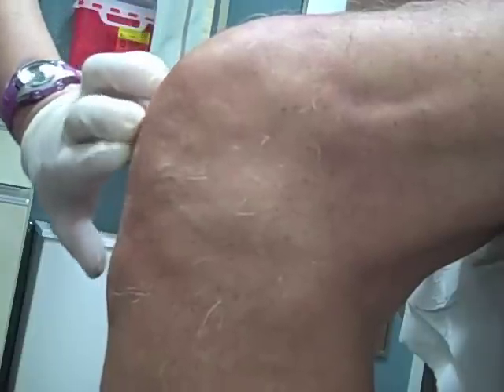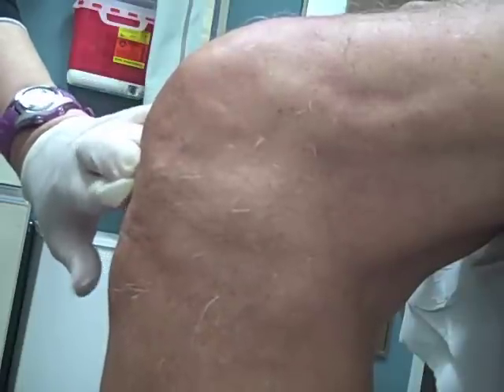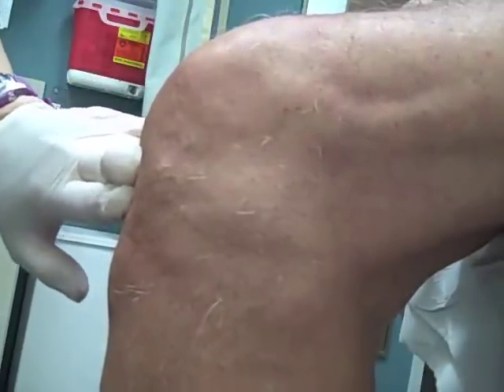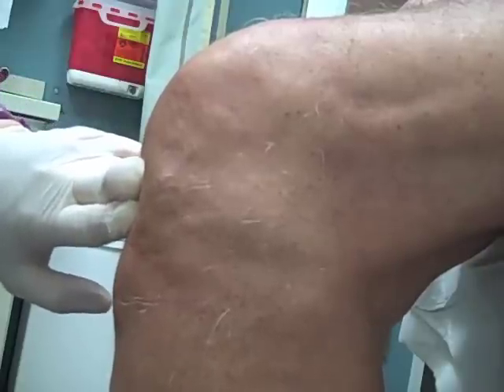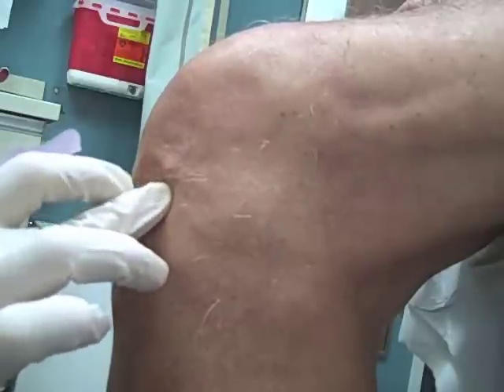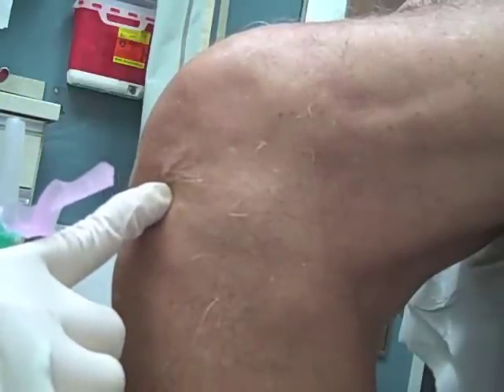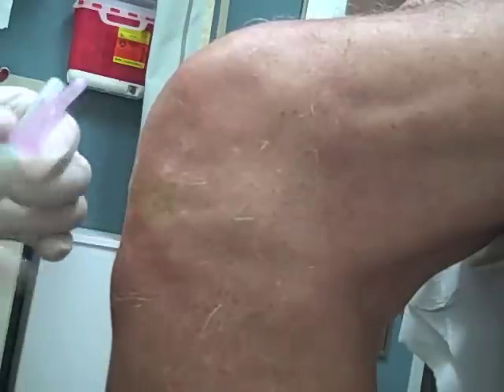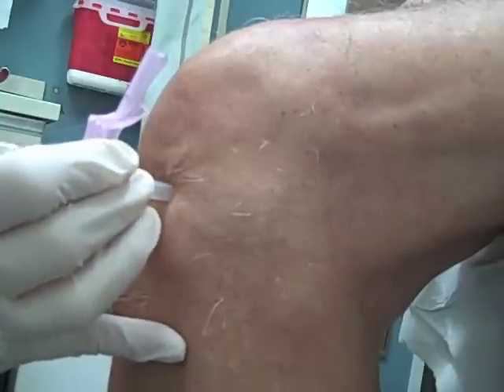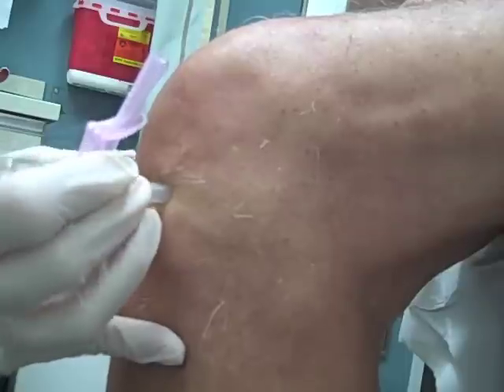At this point we'll identify the important landmarks for the injection and mark the injection site. Our landmarks will be the patellar tendon and the tibial plateau, and our injection site will be approximately one centimeter lateral to the patellar tendon and one centimeter superior to the tibial plateau. There's usually a soft indentation at that site, which is where we'll mark for the injection.